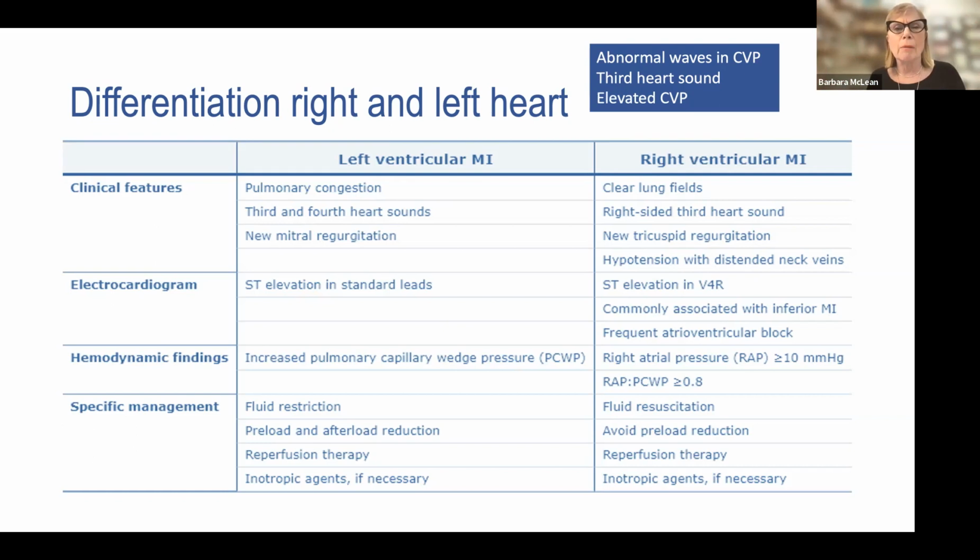Oh, that's a lot to unpack. And a lot of things affect that. But remember, when you come to the bedside, you connect your pressure tubing to the brown lumen of your central catheter, you are going to get incredible information, generally not information about volume, but information about compliance and things that are going to happen to the right heart that will then be reflected in your CVP.